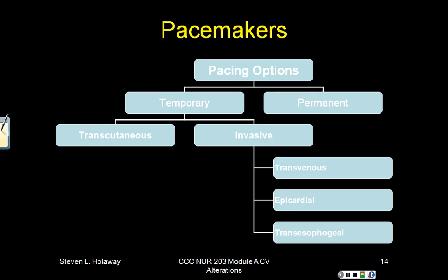Epicardial pacing is an invasive type pacing that is usually done when a patient has had heart surgery. The epicardial pacing wires are sewn directly to the ventricles of the heart and left in place for a short period of time so the patient can heal from that bypass or valve surgery. It is used in those cases to treat dysrhythmias of that patient. It can be used to treat rapid rhythms, can be used to treat blocks. So typically you will see that on our patients who have coronary artery bypass graft or have valve surgery. You'll see the epicardial. Don't see the transesophageal much, but it is something that's out there.